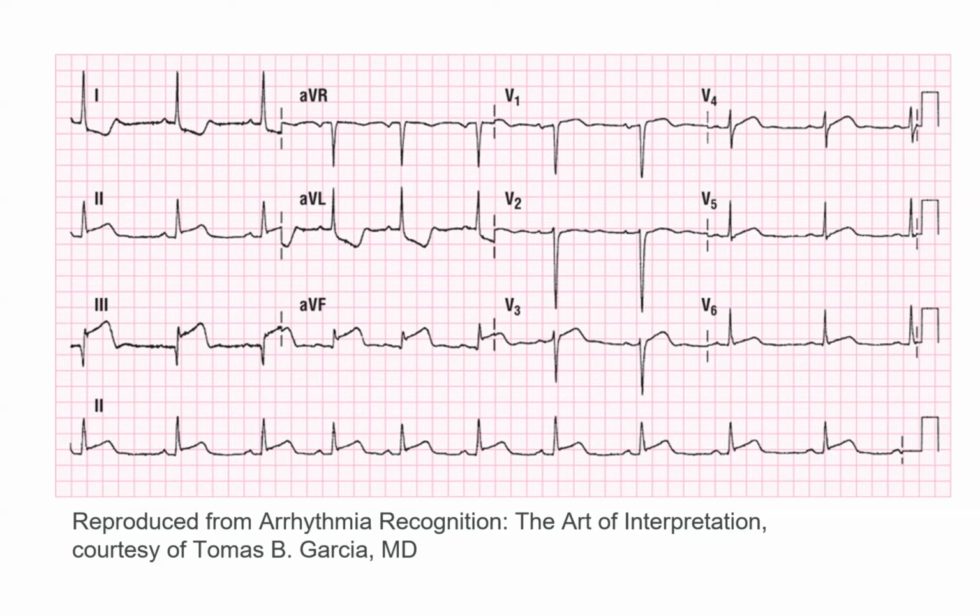If I'm good, and I don't like starting IVs in the house yet. I don't enjoy it. It's not my favorite. I like my work side space. I like to have everything set up. But in these situations, especially if he looks sick, we'll start that IV right there. Get it secured, ready to go. 12 lead's done. Hey, I'm looking at it. IV's now done. 12 lead's done. We've already given aspirin. Oh, that looks bad. Hey, are you allergic to nitro? Have you taken any nitro?